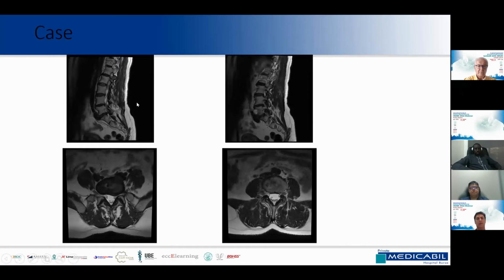the MRI. We did the injection for this case because of this MRI. You see, actually it seems a very innocent MRI. There is no severe problem, just in level 3-4. There is some SAP hypertrophy here. Okay, it can explain the pain, but also she has severe L5 nerve irritation, interestingly.